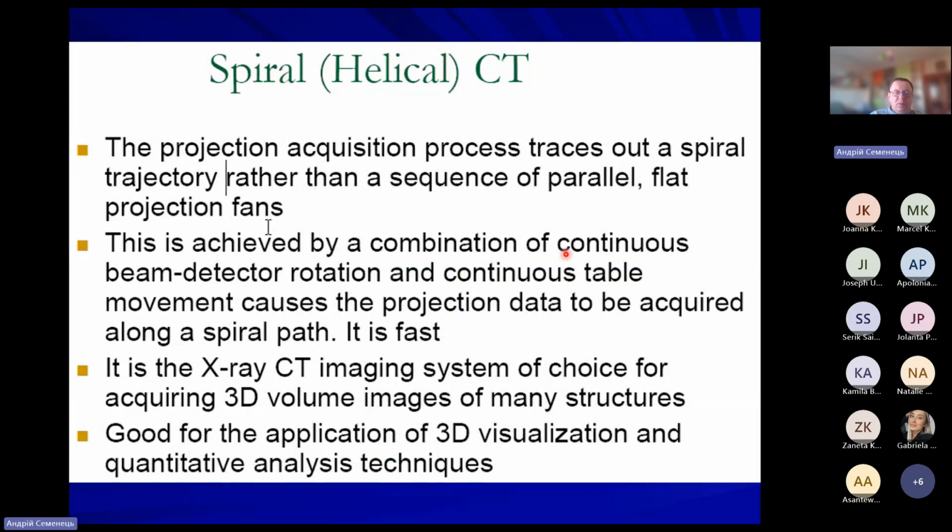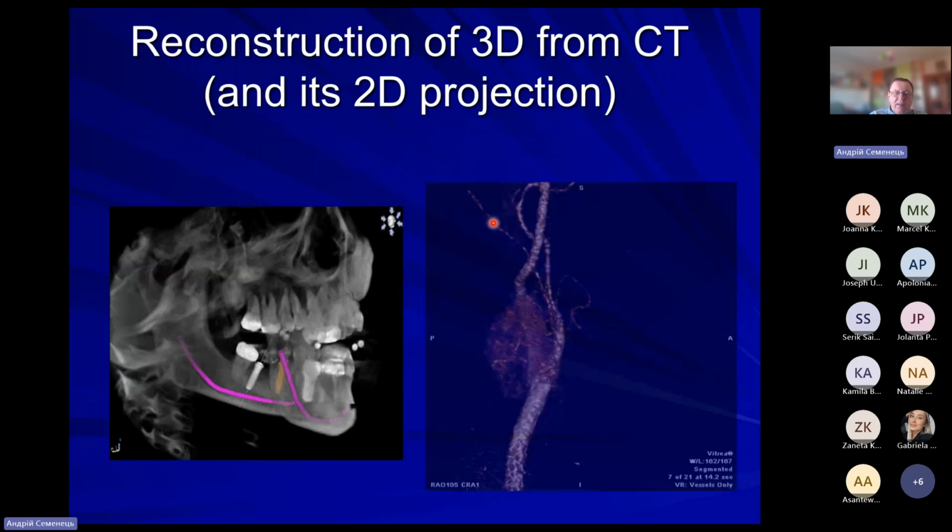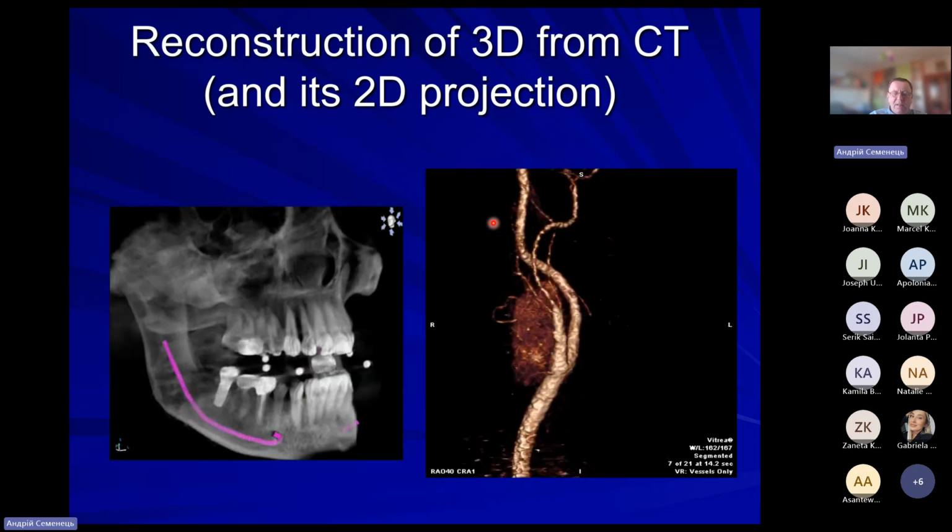And now, in modern times, we have continuous tomographs which provide a continuous scan, which allows us to retrieve not only a two-dimensional cross-section or a stack of CT scan images, but an actual three-dimensional visualization. So here is so-called slice-by-slice scanning or spiral volume scanning, which allows us to reconstruct three-dimensional images like the one given at right, and even create dynamic visualizations like this one.